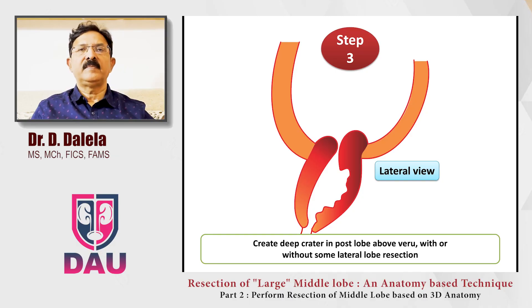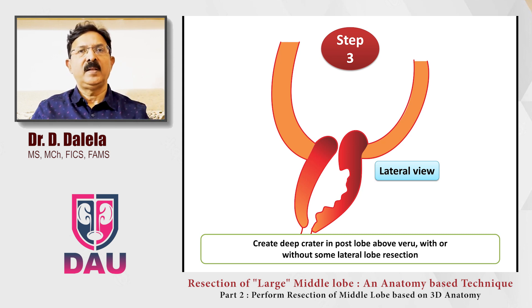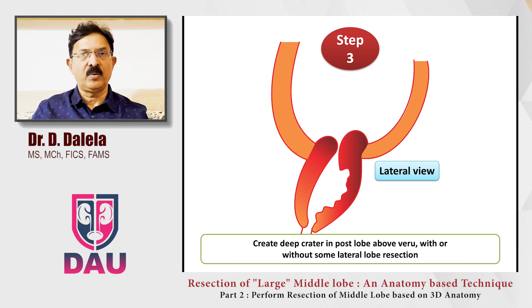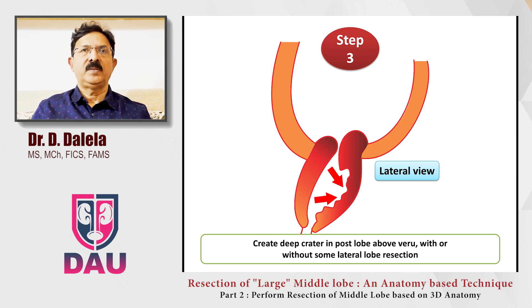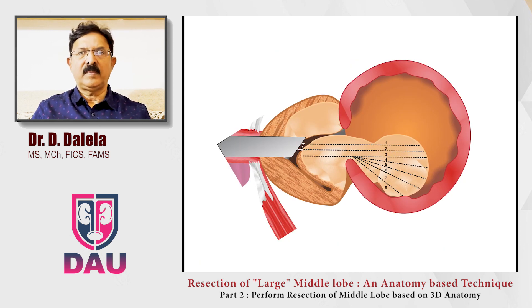The third step would be that when you have resected the two-thirds of the middle lobe and now want to resect the base part, it is only during resection of the base part that you create injuries to the trigone or ureteric orifices, or even sometimes cause trigonal perforation. So here I suggest that you come below the bladder neck, park your tip of the resectoscope at the verumontanum, and resect the tissue just above the verumontanum in the posterior lobe, creating a crater there.